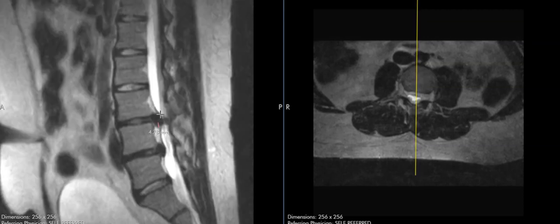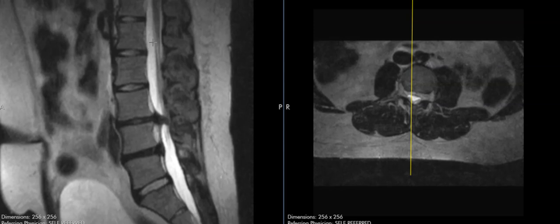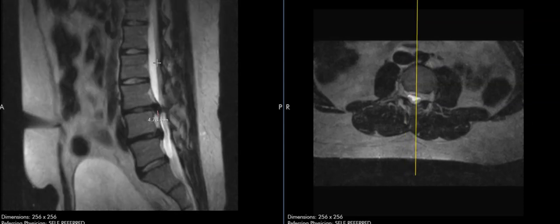They have a prominent central disc herniation with a little bit of inferior migration, and we can see the central spinal canal filled with this white fluid. This is the spinal cord coming down. We see the fluid in the spinal canal, a big wide open spinal canal until we get to this disc level and we see that disc herniation causing a severe stenosis, complete cutoff. We don't see any communication between the fluid down here and up here. So this is an acute disc herniation causing bad back pain.